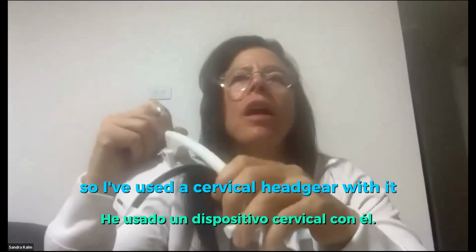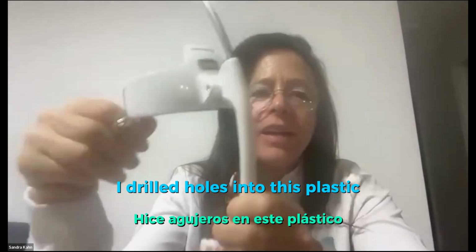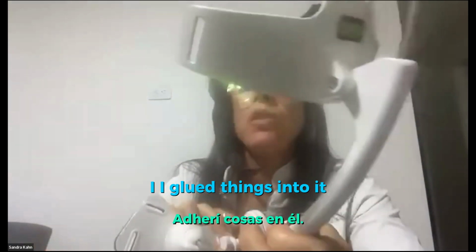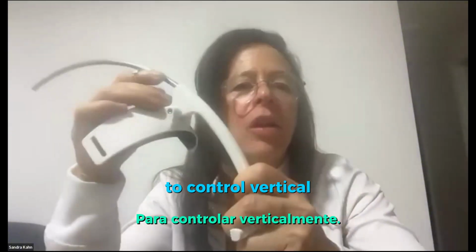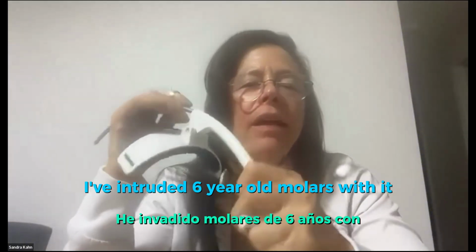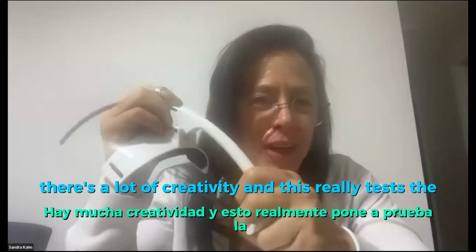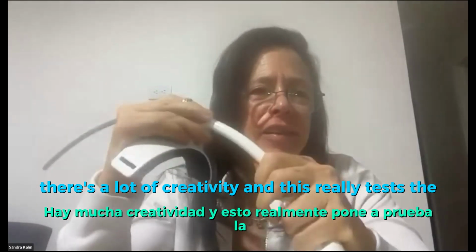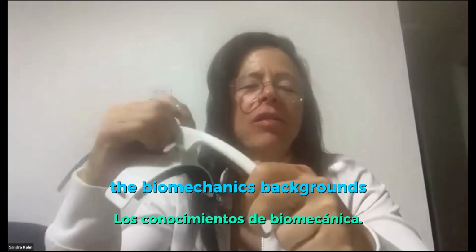So I've used cervical headgear with it. I drilled holes into this plastic. I glued things into it to have the patient wear elastics to control vertical. I've intruded 6-year-old molars with it. There's a lot of creativity, and this really tests the biomechanics background.